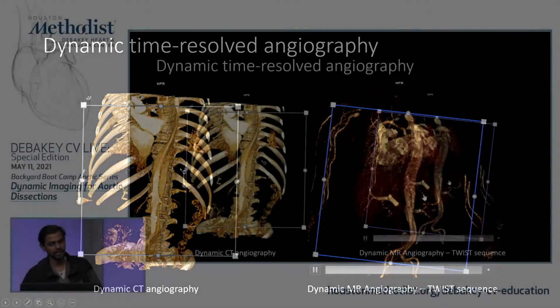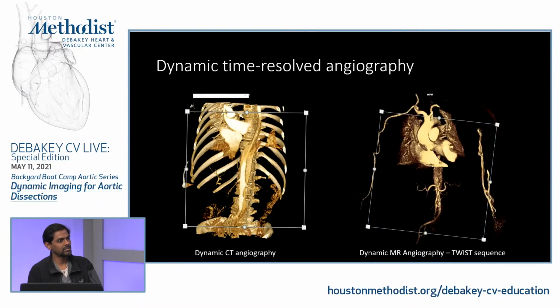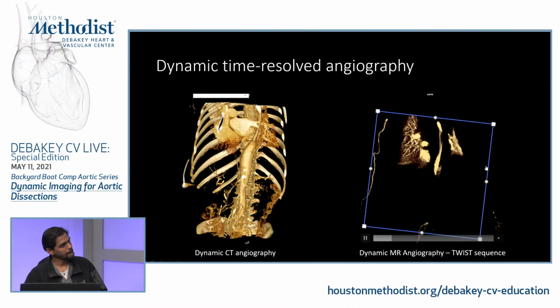And the reason I'm saying that is it's really up to the clinical question. We decide which modality we should use. Yeah, I think that's what I talk about as strategic imaging.